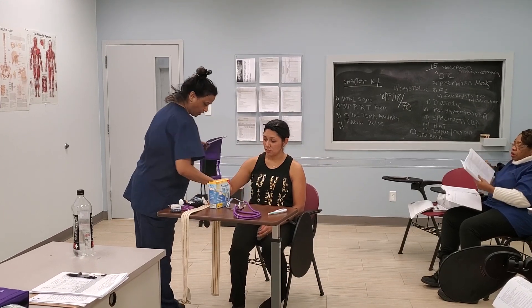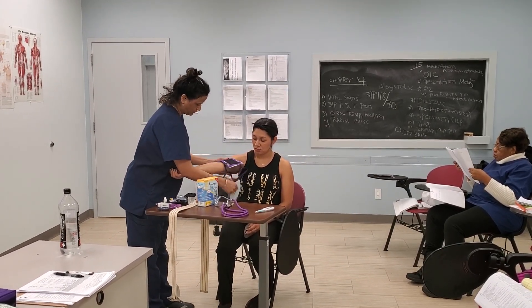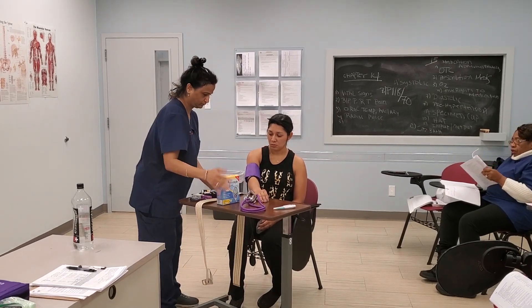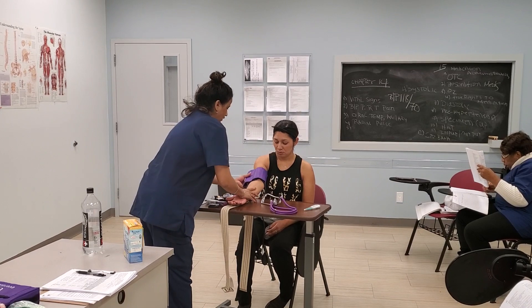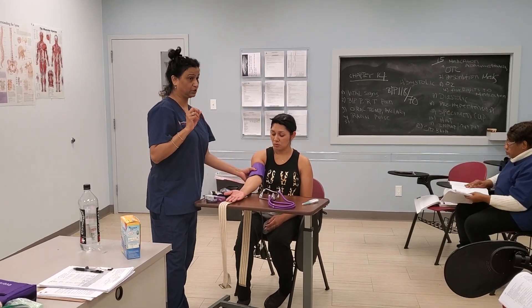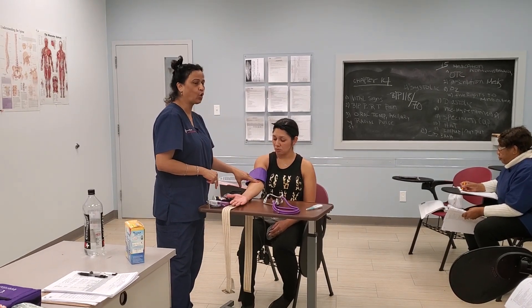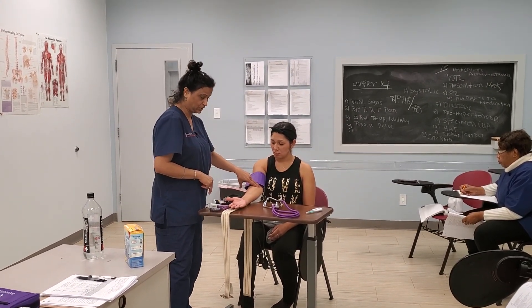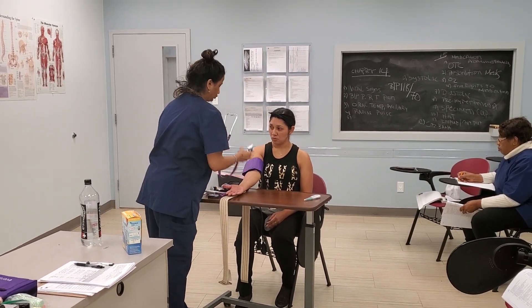Miss Yolanda, I am going to place the cuff around your arm. Make sure she's nice and relaxed. Make sure the blood pressure cuff fits snugly — not too tight or too loose; it has to be two finger-breadths. Then palpate the brachial artery. I can feel her brachial artery right here, so that is where I am going to place the diaphragm of my stethoscope.